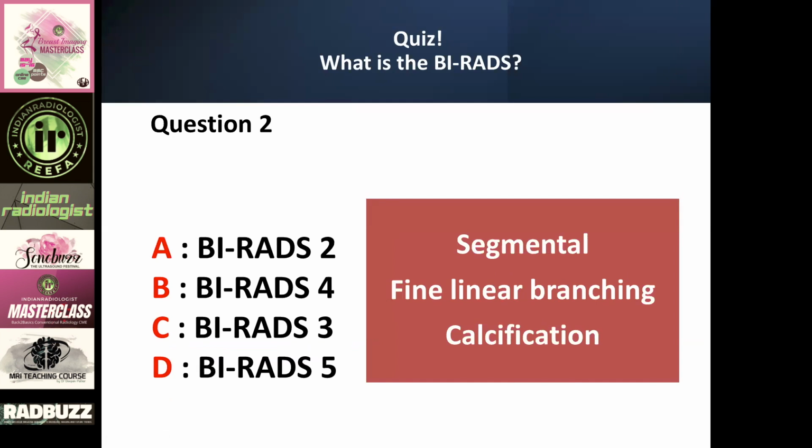So, ma'am, 40% are for D, the last option, and 38% for B, second option. Okay, so the B and the D, overall it's not bad because irrespective of what you choose, it's biopsy. So the patient is not being harmed by choosing either this or this, you need biopsy. But the correct answer is actually BIRADS 5.